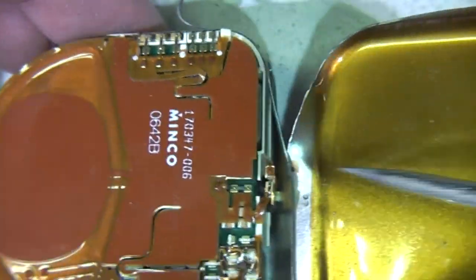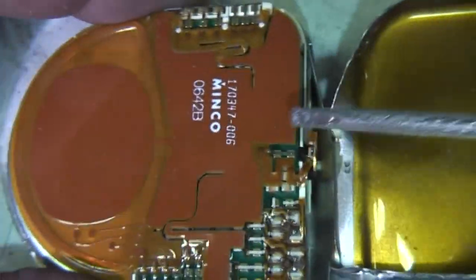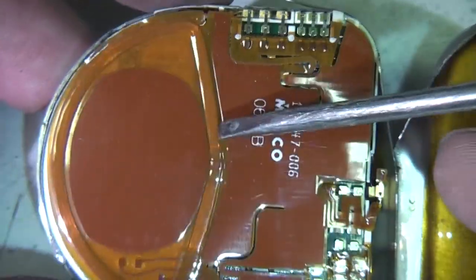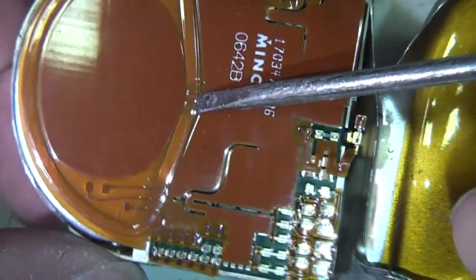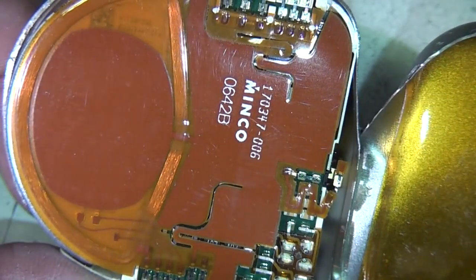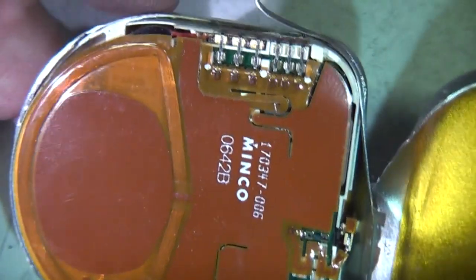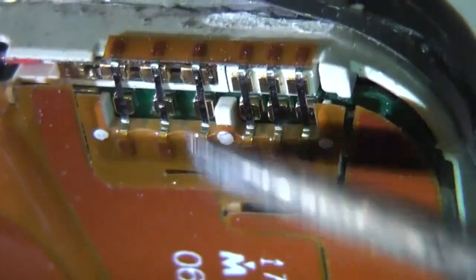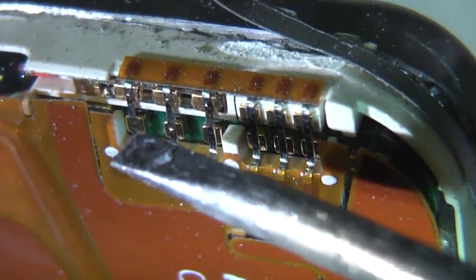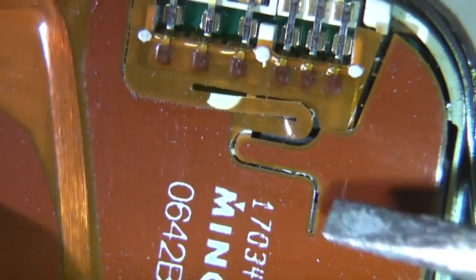I've cracked it half open so far. There's some insulating there. This looks like Kapton this part of the can. There's what looks like a coil here. This is probably an induction loop for communication, so that this thing can be set up by using a coil held outside the patient to set the parameters, do data logging and monitoring and so on. And the connections to the main boards, they seem to have got these sort of blocks which I think look like the surface mount, and then these have been ultrasonic welded onto this flex on the back.